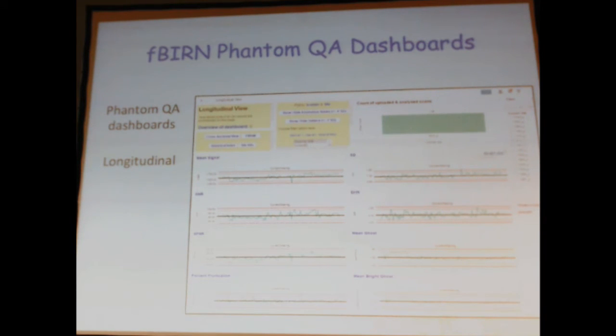So we started off with this idea that we had these 16 parameters, and we'd put standard deviation bounds in the standard univariate way, very simple-minded quality control. And it quickly became obvious that trying to track these 16 parameters across 13 scanners over time, you can say, yes, that went outside 3 standard deviations at some particular point, but it really wasn't helping us gain any understanding about the relative performance of the scanners, which was one of the goals.